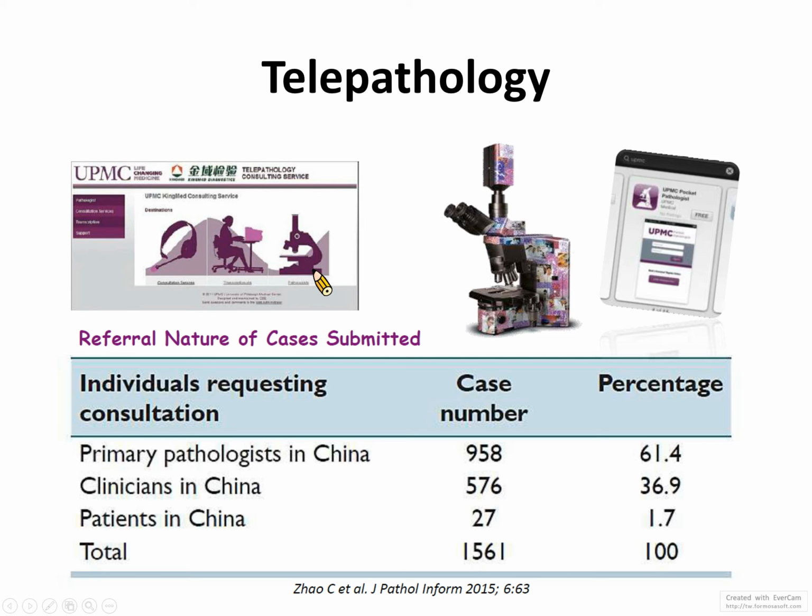This is very important because not only can you apply some algorithms to identify the abnormal tissues, but the digitalization of pathology images will also enable telepathology, letting doctors in a remote hospital consult the pathology images with other doctors in another region.